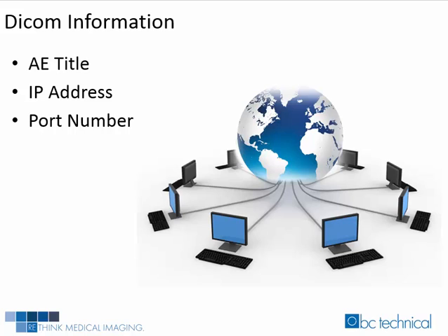The second defining characteristic is the device's address known as an IP address. This is a numerical label that identifies the device, such as a street address. And the third piece of information is the port number, which acts like a zip code. Some institutions have different zip codes because they are very large and share a lot of data. So port numbers help keep data in the same networks so traffic doesn't slow down.